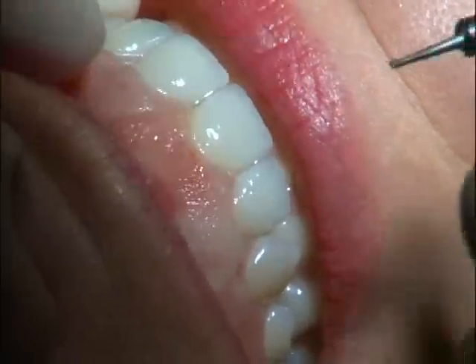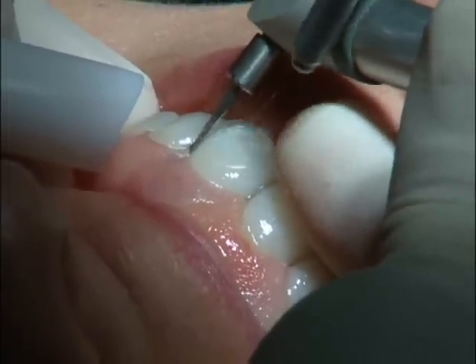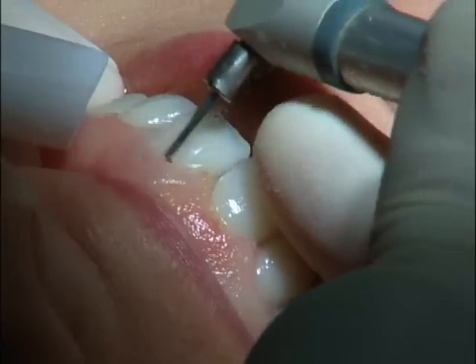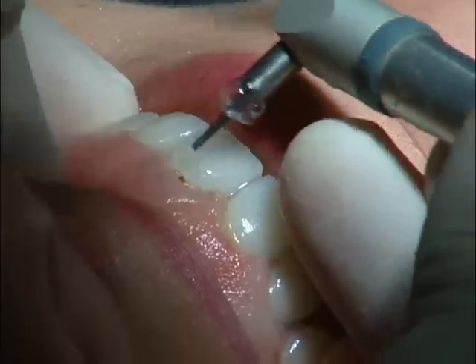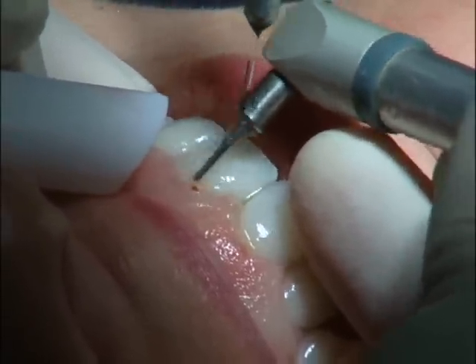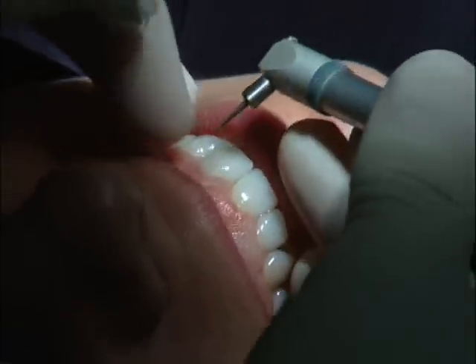Now I've done that. And now I'm going to do just a touch to the implant. And then we're going to turn the setting down a little bit more and go into the sulcus for the implant. Let's just make this contour right here. We'll wipe that off. This spot right there.